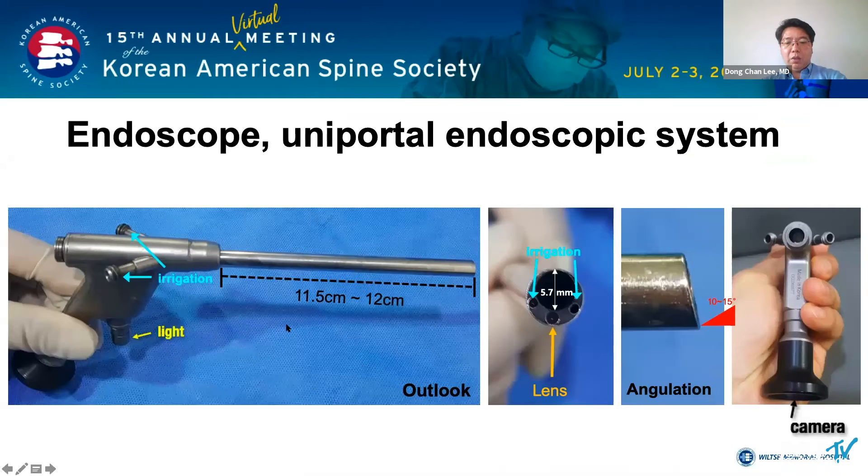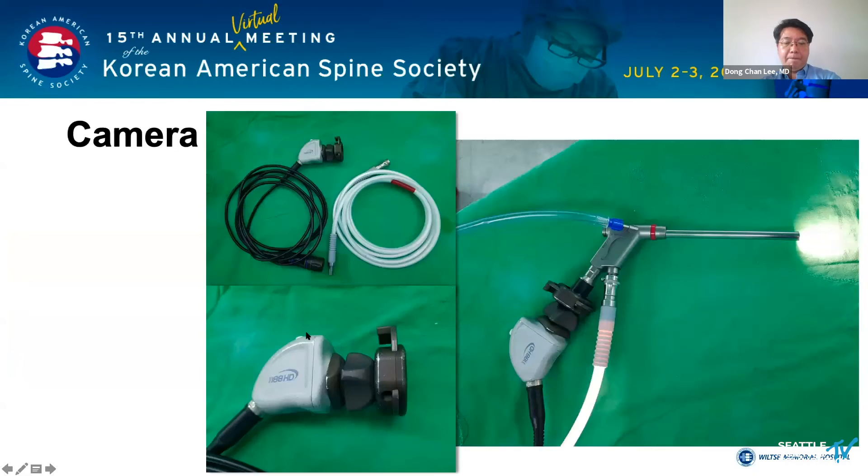The spinal endoscope connects with the irrigation line, light source, and camera. The lens of the endoscope has an angle of 10 to 15 degrees. When you assemble the camera, light source, and irrigation line, it looks like this.